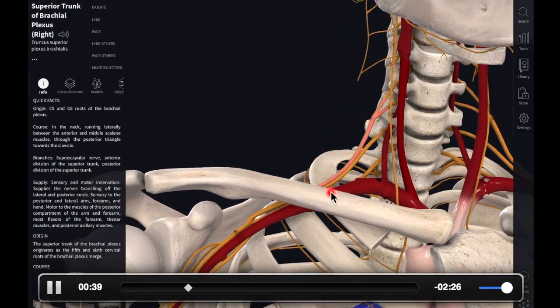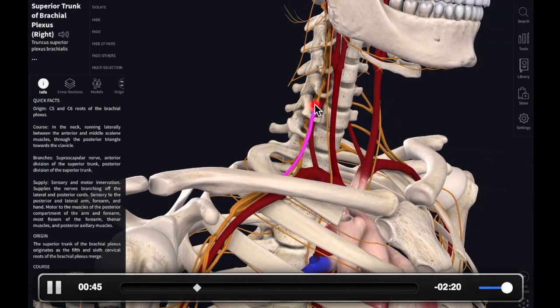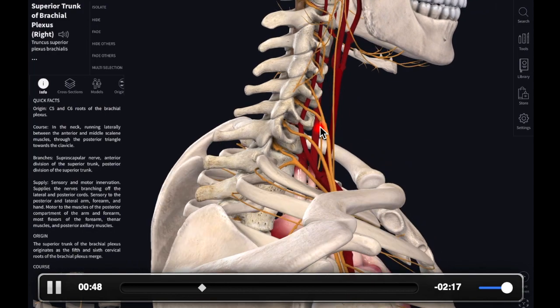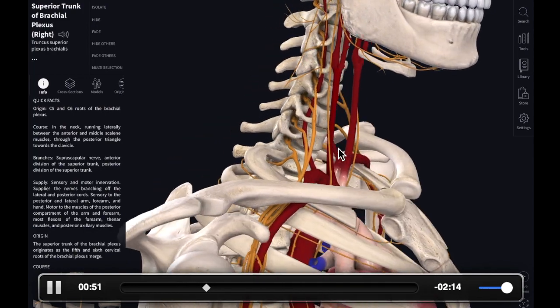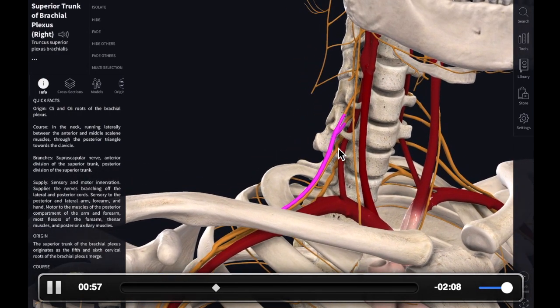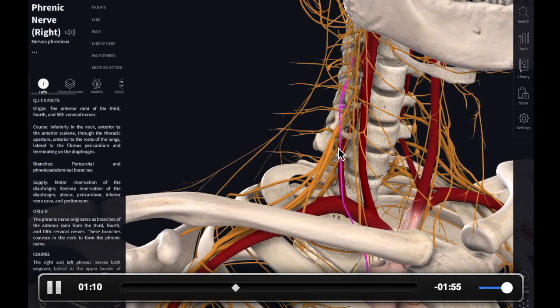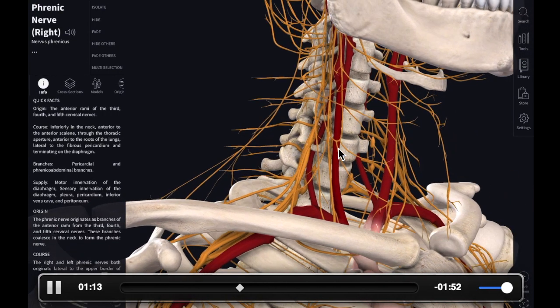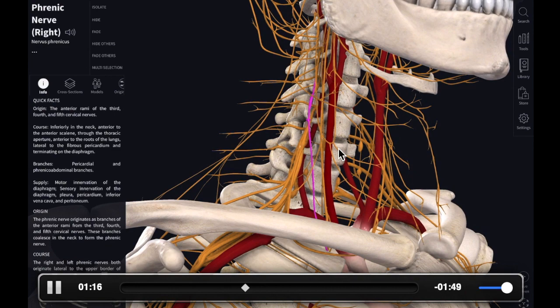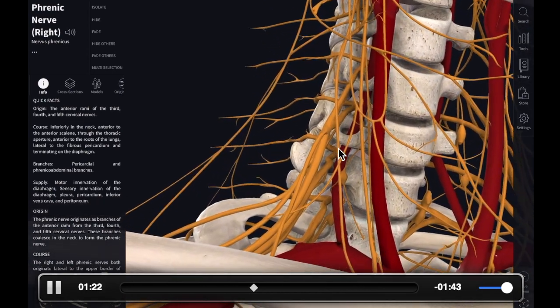That subclavian artery location is going to be our starting point when we're doing our scanning. We're then going to take our probe and scan up the patient's neck until we see C5, C6, and C7 in this interscalene region. The brachial plexus is formed by the anterior rami of nerve roots C5 through T1. Nerve roots C8 through T1 can be located deeper in the neck and not reliably blocked with this approach. The supraclavicular nerves of the cervical plexus are indirectly blocked from the spread of local anesthetic out of the interscalene groove, and these branches supply the superior aspect of the shoulder.